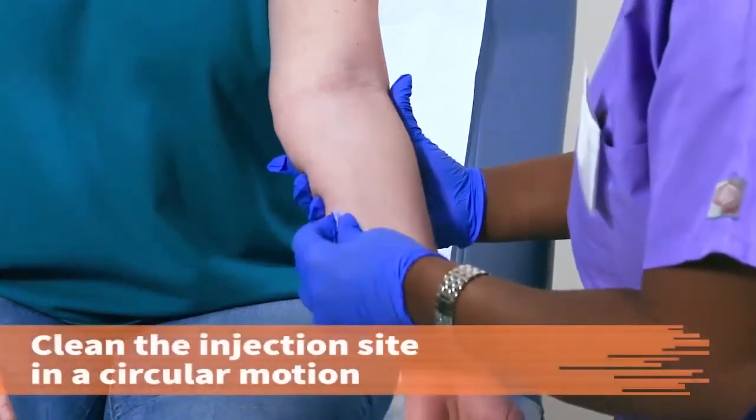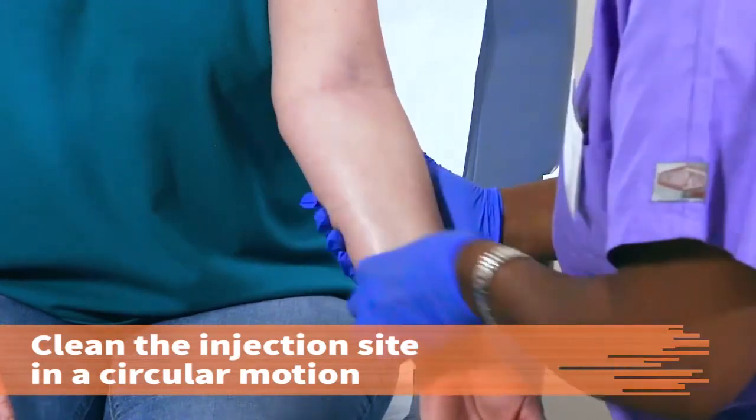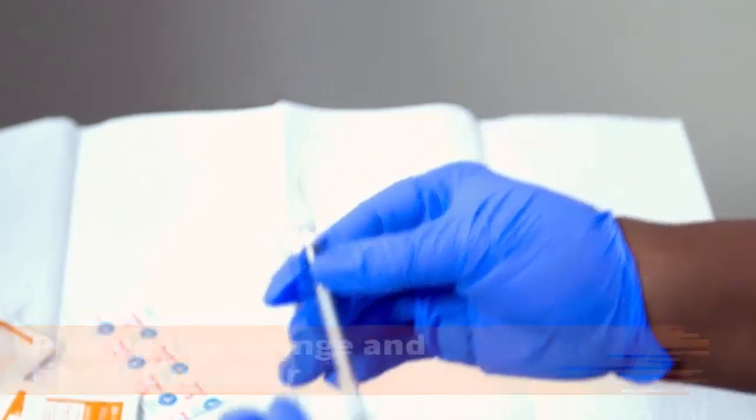Cleanse the patient's skin with an alcohol wipe using a circular motion, moving from the center outward and creating about a 2-inch area. Allow the antiseptic to dry. Pick up the syringe and tip it to remove the cover.